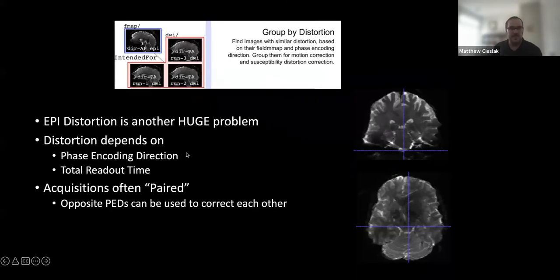But these warped groups are detected, and they have to be detected automatically because the BIDS specification, at least BIDS 1.0, didn't have an option to use a DWI image to distortion correct another DWI image. So oftentimes acquisitions would have one set of AP phase encoding directions followed by another set of scans with PA phase encoding directions, and you would extract b=0 images from each of those, use those in TOPUP, and that would be your distortion correction.